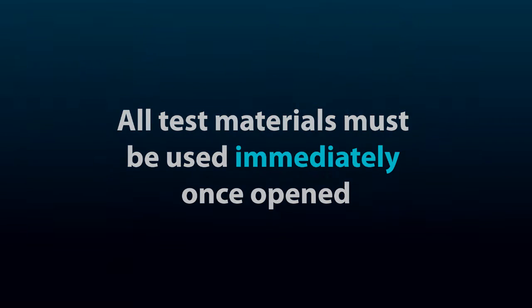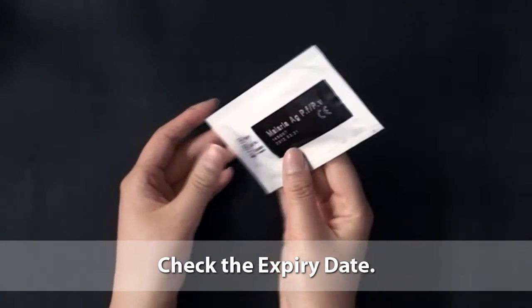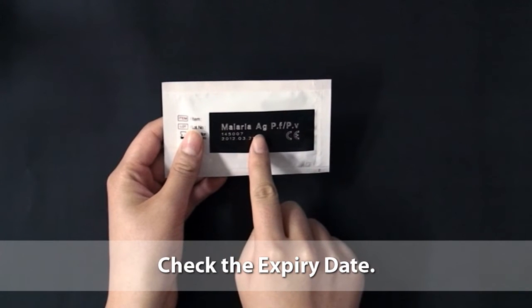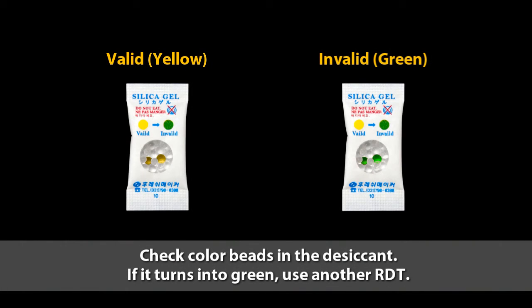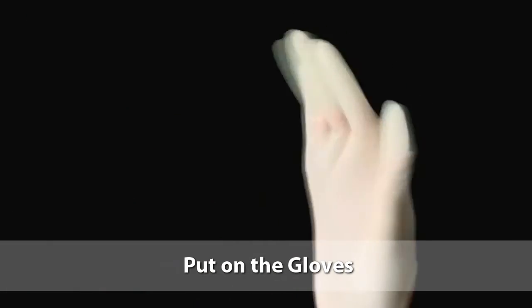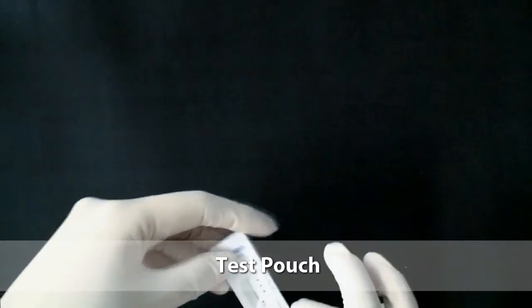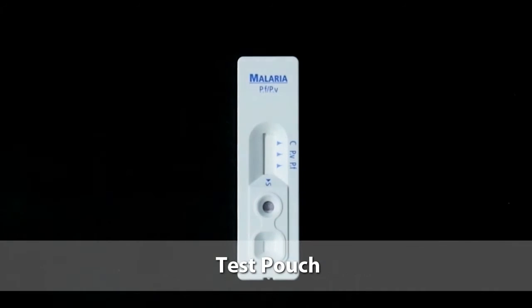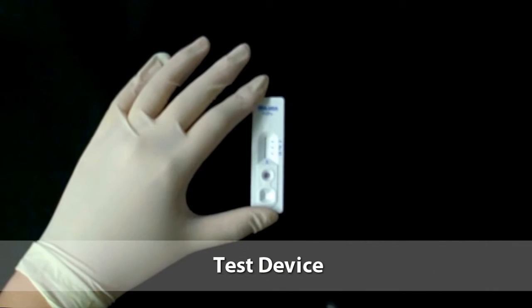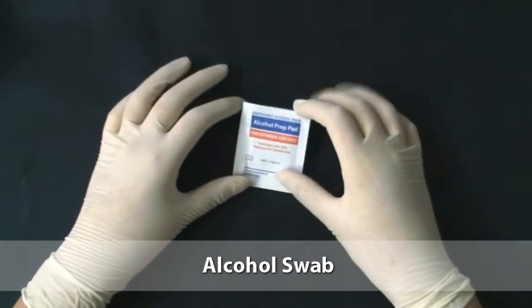Let's begin the test. Check the expiry date on the back side of the test pouch. If the expiry date has passed, use another kit. Put on the gloves. Remember, use new gloves for each patient. Open the test pouch and set the test device. Write the patient's name on the test. Open the alcohol swab.